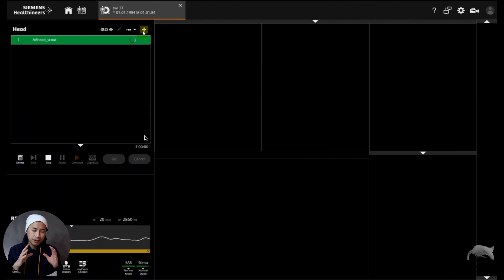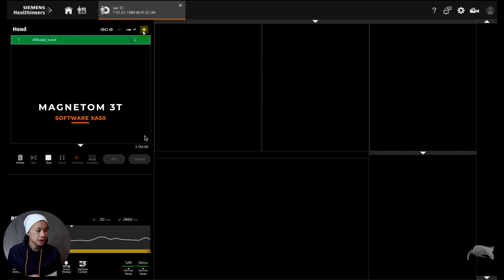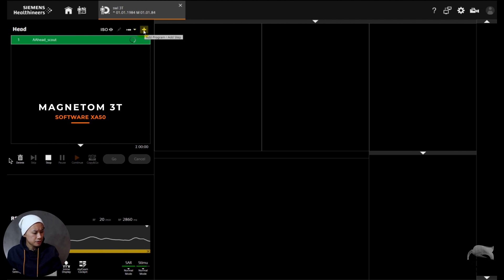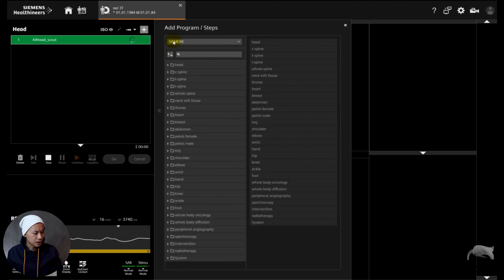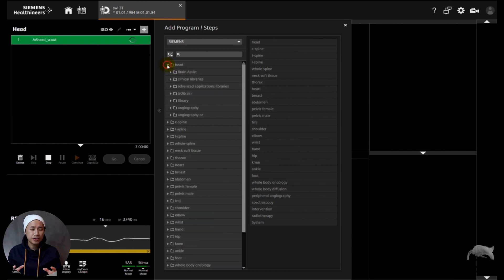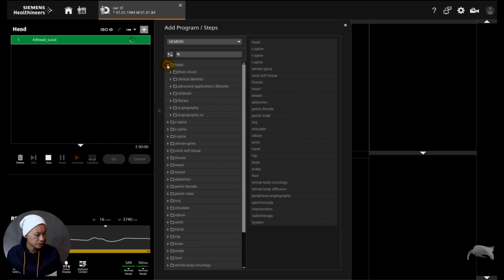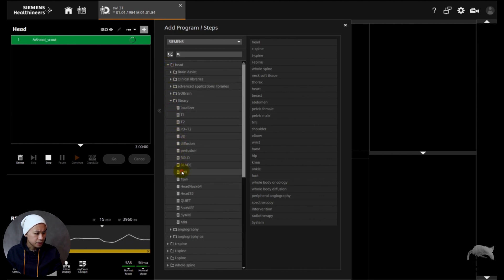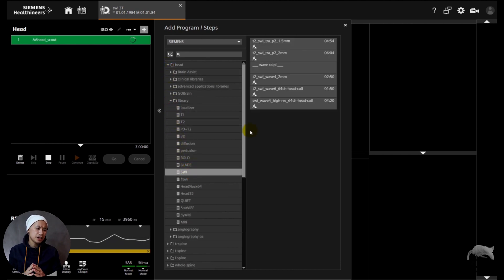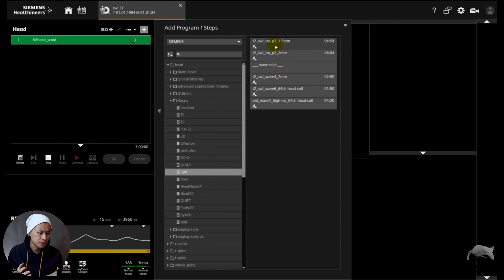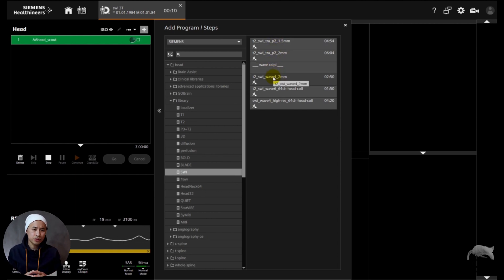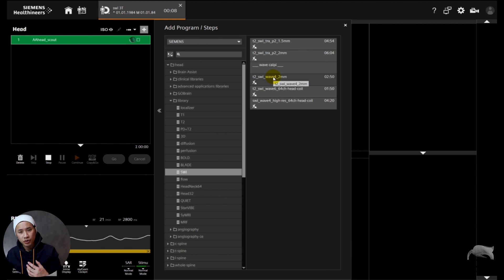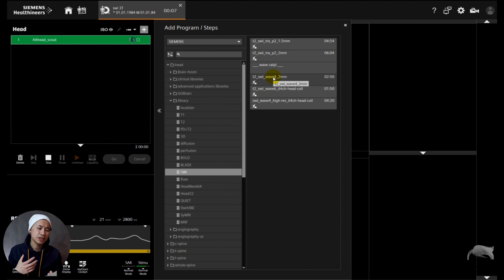So we are at 3T — the thing I'm about to show you is meant for 3T — and we're gonna do a localizer first. We go to the CMS3 and we're just gonna pick a SWI sequence and take it straight from the library. Go to library, go to SWI, and there are a lot of options here. I'm just gonna pick one and do the original versus a modified one so you can see the differences.